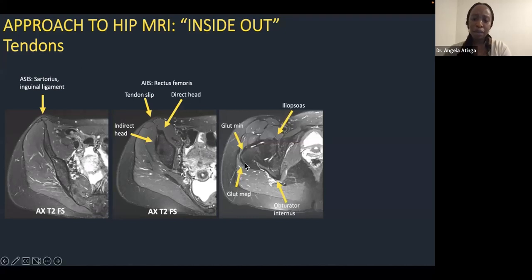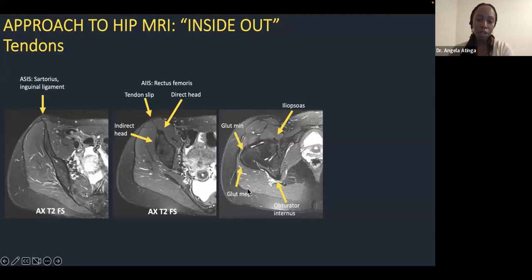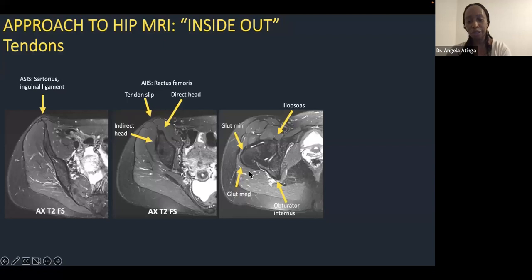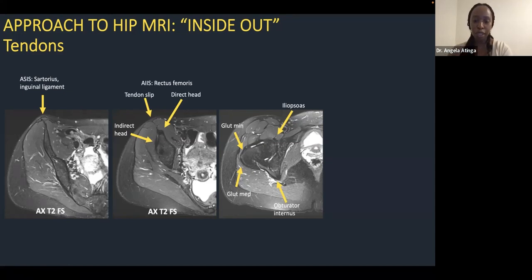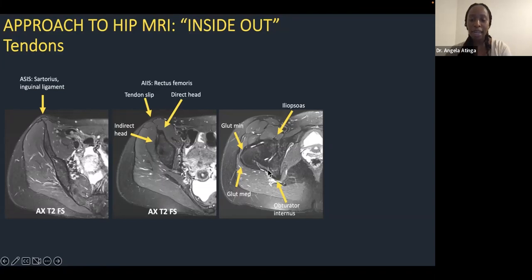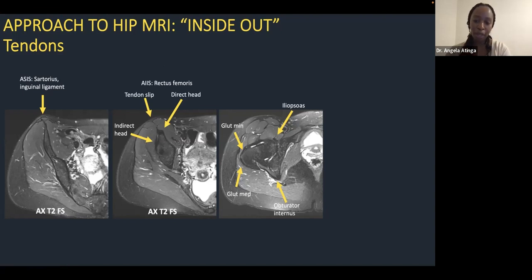Moving distally, the next landmark is the greater trochanter where the gluteal tendons attach. Anteriorly is gluteus minimus, and posteriorly is gluteus medius — analogous to the greater tuberosity in the shoulder, with gluteus minimus equating to supraspinatus and gluteus medius to infraspinatus. Posteriorly, the obturator internus muscle and its extra-pelvic tendon provide a window to see the short external rotators: the superior and inferior gemelli, piriformis tendon, and the obturator internus tendon. Immediately anterior to the hip, adherent to the capsule, is the iliopsoas tendon — the most anterior structure — which tracks down toward the lesser trochanter.